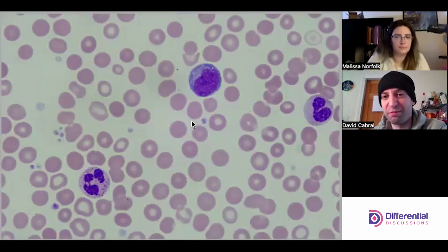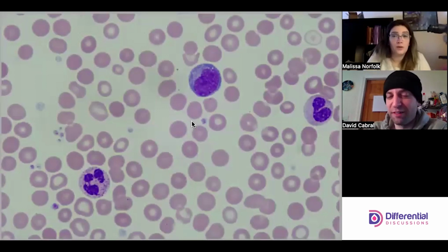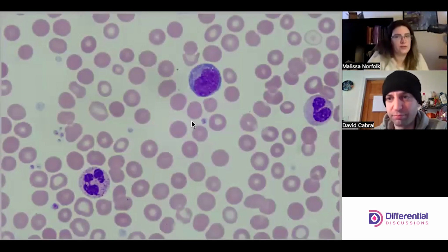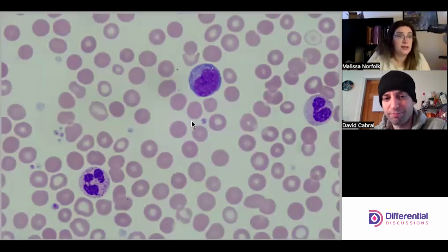That's what I'm guessing I would probably call this one. Yeah, no, I would. He's really nice and reactive looking. He doesn't look like a Downey type reactive lymph, the stretchy one, but he's still a reactive lymph with the deep dark basophilia in the cytoplasm. It's pushing the nucleus off to be eccentric. Like Dave said, it's plasmacytoid. He's probably moving towards a plasma cell, but this is another type of reactive lymphocyte.